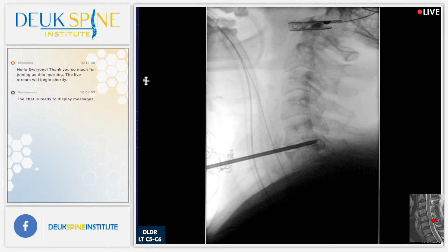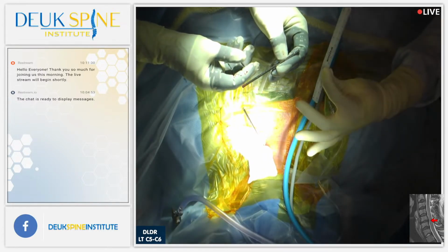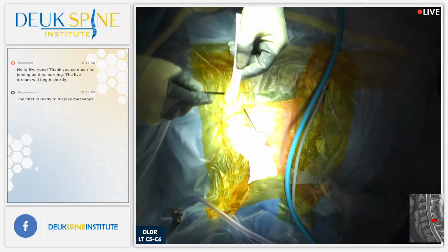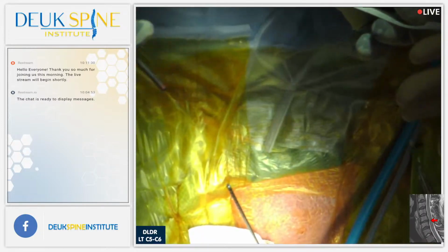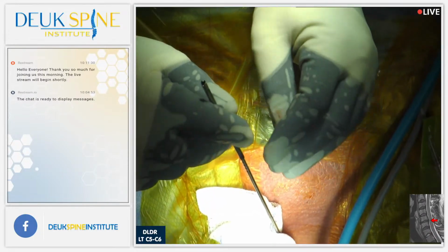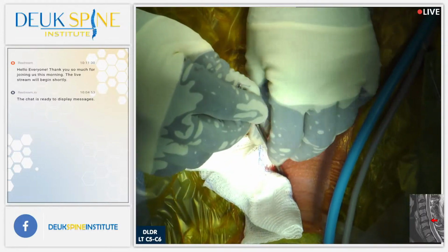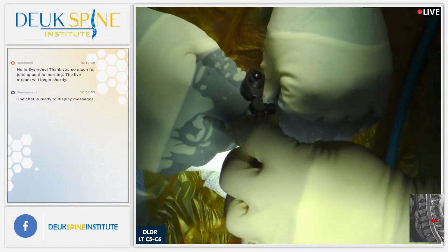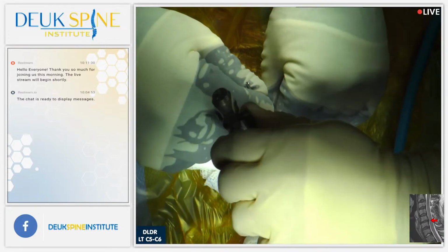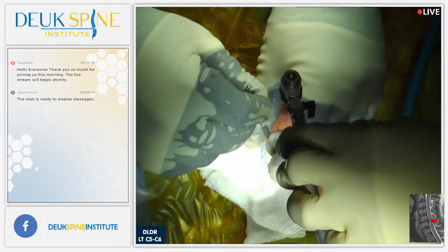Now, let's show the audience here, Henry. We're going to do the entire surgery on the neck through a tiny little tube. You guys see the tube here? Yes, we do. This tube is literally 4 millimeters wide. So that's why we're able to do the surgeries minimally invasive, because we don't need much room to get it done. And by doing it this way, we're not removing the actual disc. We're not doing a discectomy. We're doing basically what's called a herniectomy and an annular debridement.